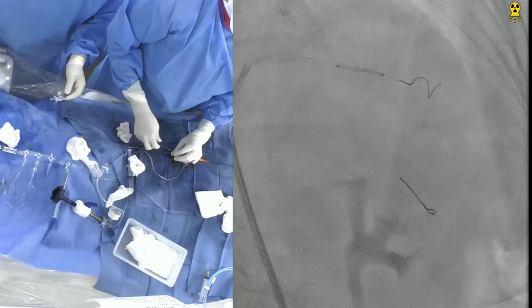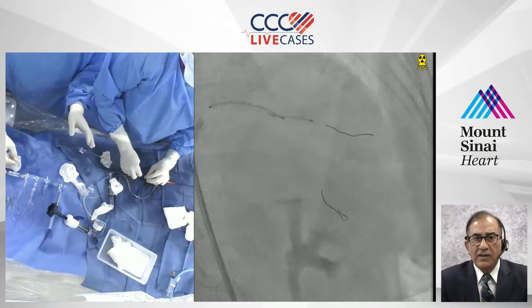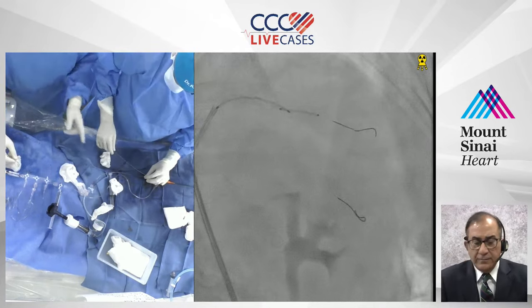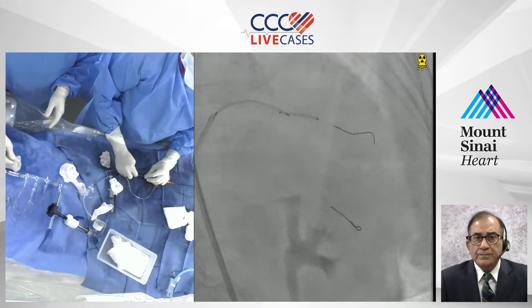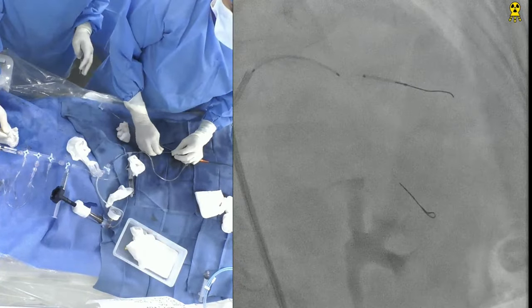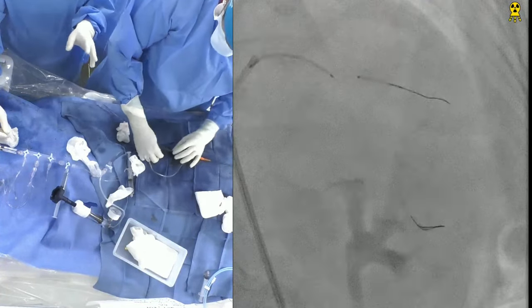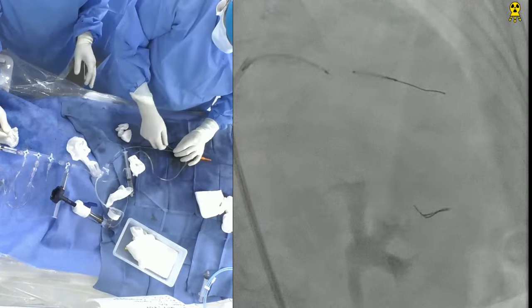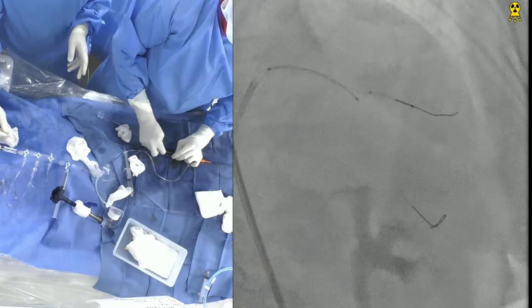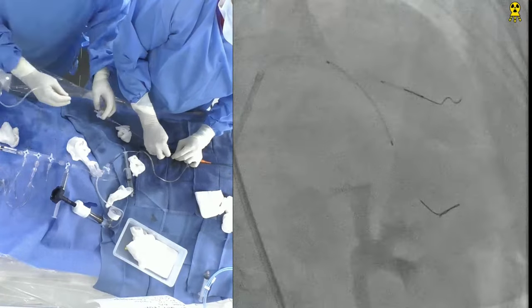Well, I have a feeling it is, and besides, I think just the location of the proximal LAD would... The diagonal stent further in, yeah. No, right now our stent will go further down, because there is a lot of disease there, so we'll go from the septal. That area, which is angiographically tight, looks 60 to 80%. We are not going to put a stent there at present, because this stent is going to go further, yeah.